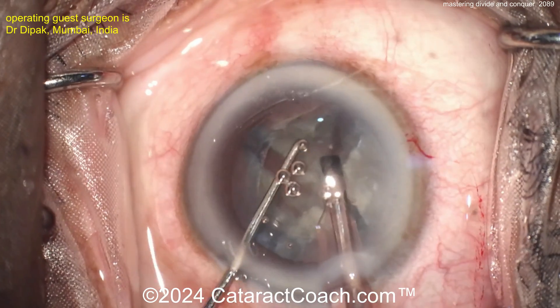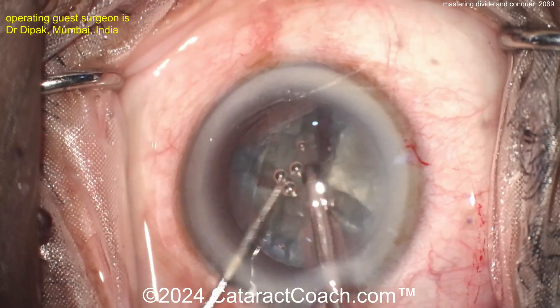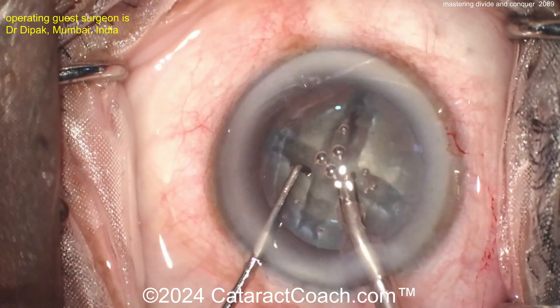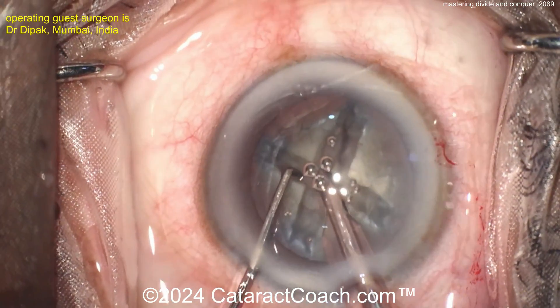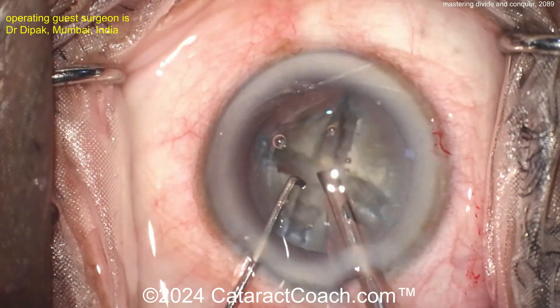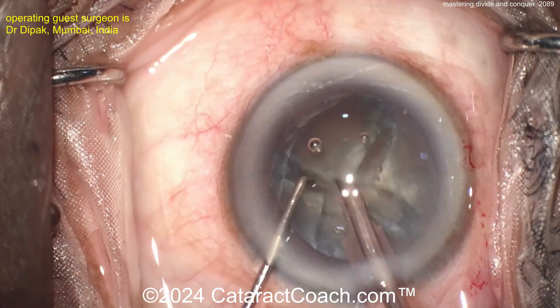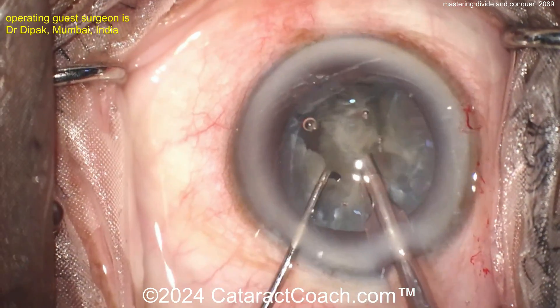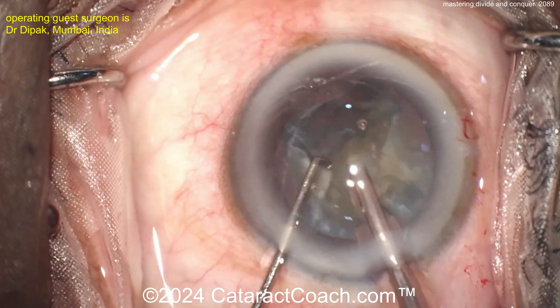Now you can change your vacuum settings to higher vacuum. Make sure that piece is separated. You want higher vacuum — at least 250 millimeters of mercury, maybe 300 or 400. You definitely want a little bit more phaco power to emulsify, and increase your flow rate to at least 25 to 30 cc's a minute to let things happen a little bit faster. That piece was brought up with a little sub-chop — I like that technique too.